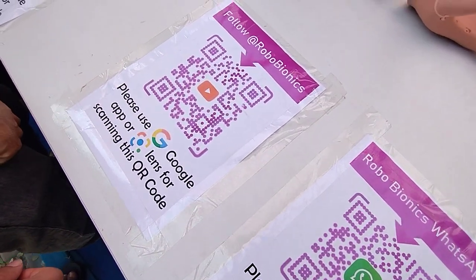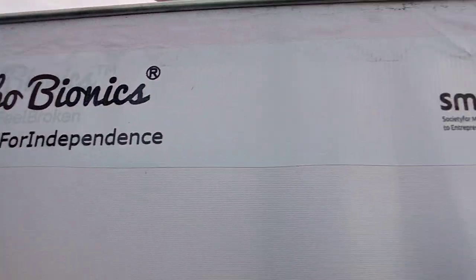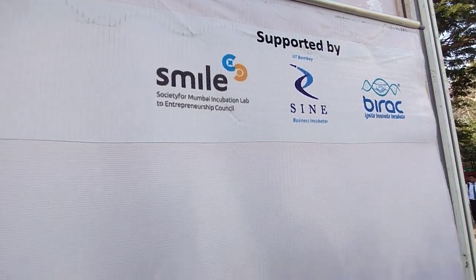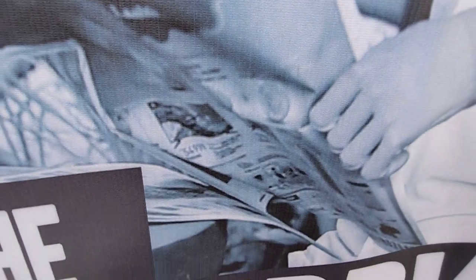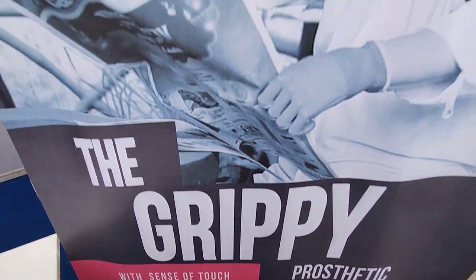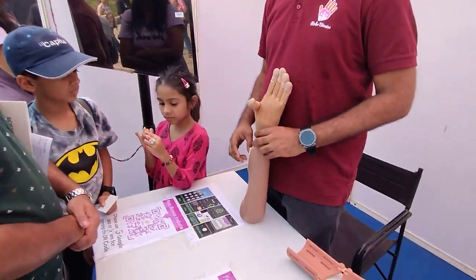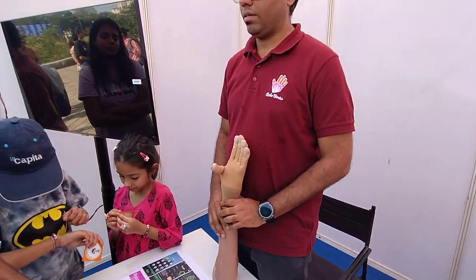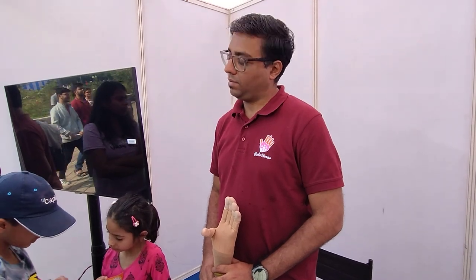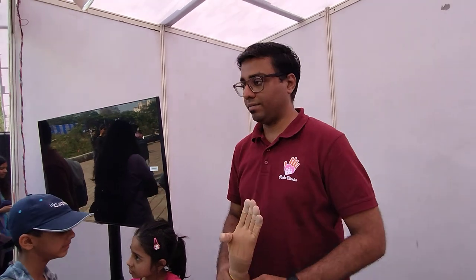So where are these all available, if someone wants to have it? So the manufacturer, our setup is in Mumbai. So when this comes up, is it custom measurement or the standard? No. So this hand is fixed, this part is customized. Custom made, right? So for every user, you will have a measurement taken and then create it, because their amputation lengths vary.